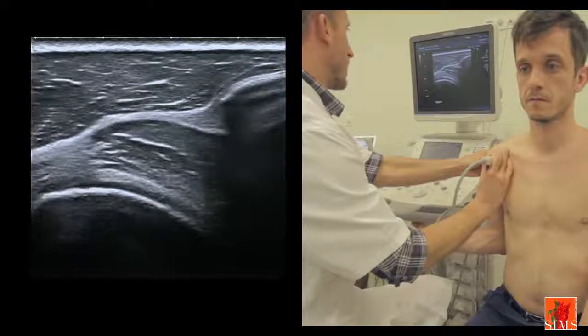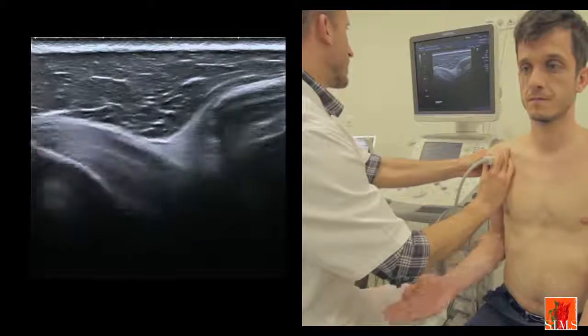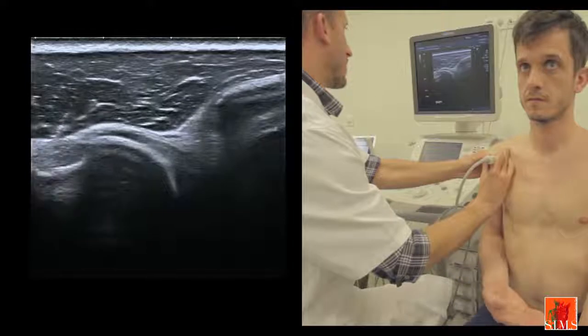In some cases, there is a spontaneous snapping or a calcification. Please note that here the space is especially large.